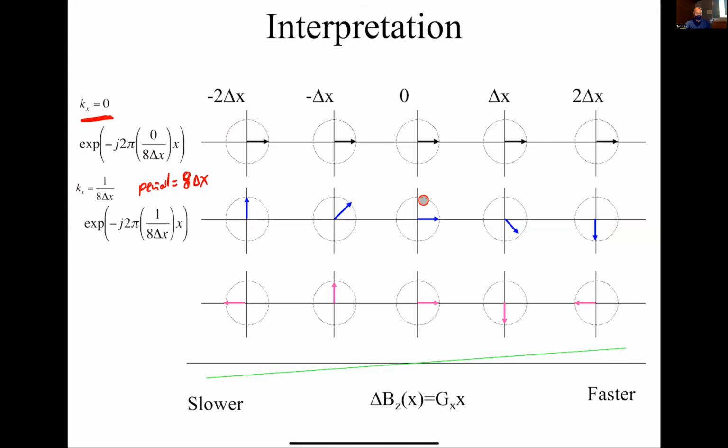So if I look at this, here's the isocenter, right? This is always at 0 phase. And then these are going to be more negative. And the phase increases as I move in this direction. And here, I'm moving in the counterclockwise direction. This is very similar to what we did in our example, except here I've taken smaller step sizes, right? Instead of, yes, go ahead.